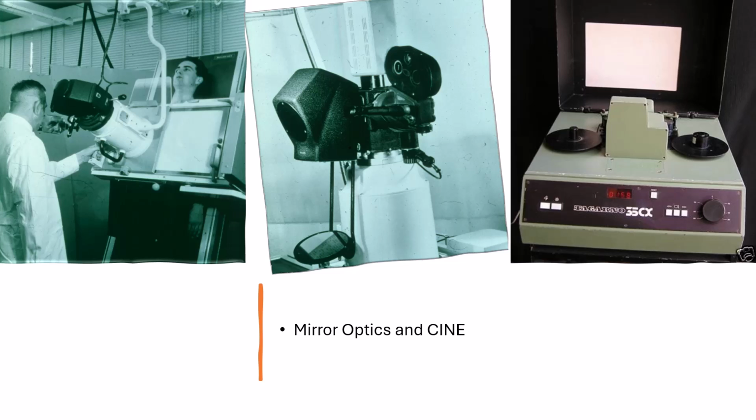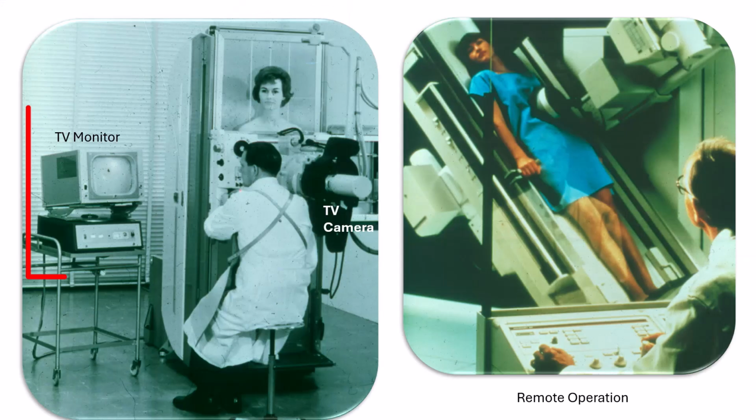It is important to note that modern fluoroscopes have undergone significant advancements. The mirror optics was replaced by a TV camera and a TV monitor, which allowed the radiologist to view images on the TV screen. And at some time, they went to a remote system which would protect the radiologist from getting exposed during the procedure. This didn't last long because it was not very practical.